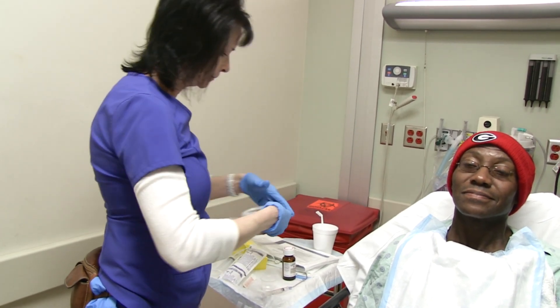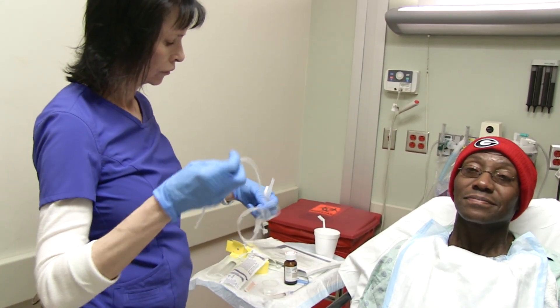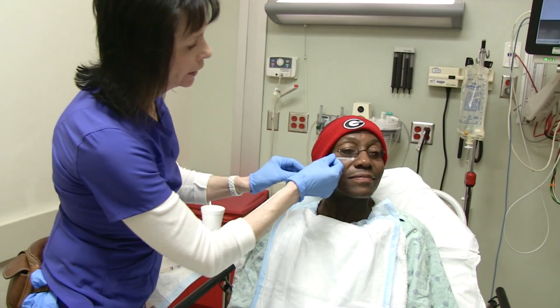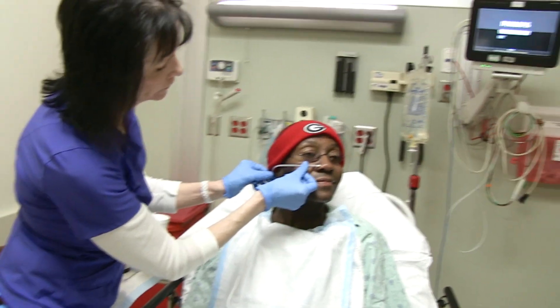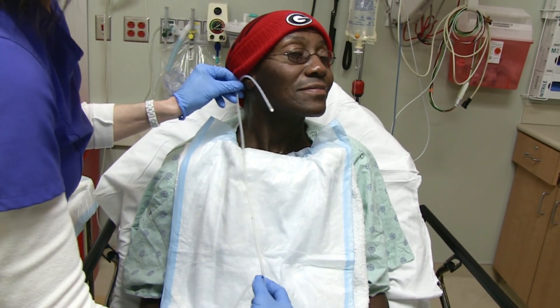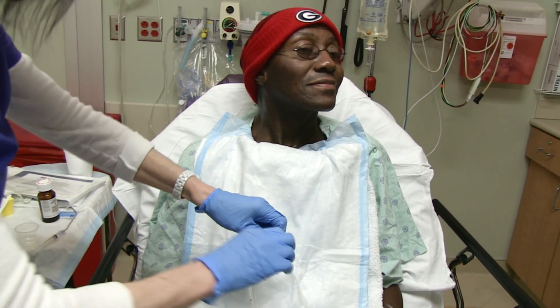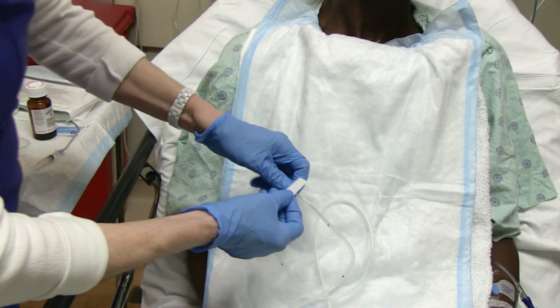Go ahead and just prepare this. Turn your head sideways like this. We're going to measure from the nose to the ear, and then from the ear to the xyphoid process. We're going to put just a little piece of tape there so we'll know how far we need to go.